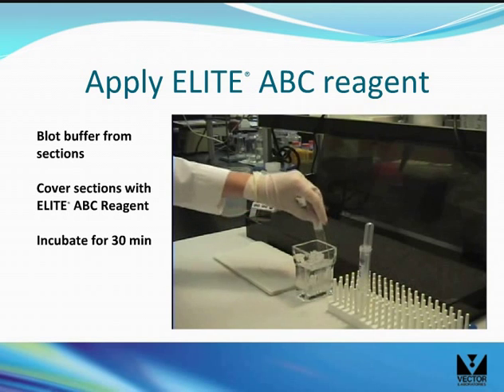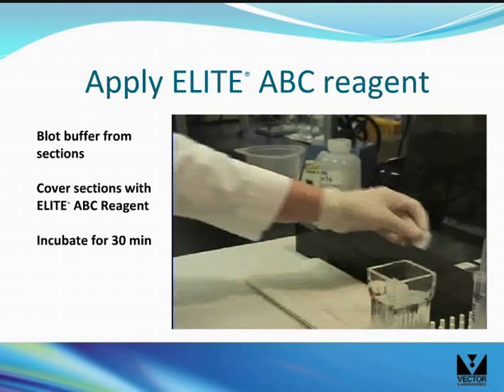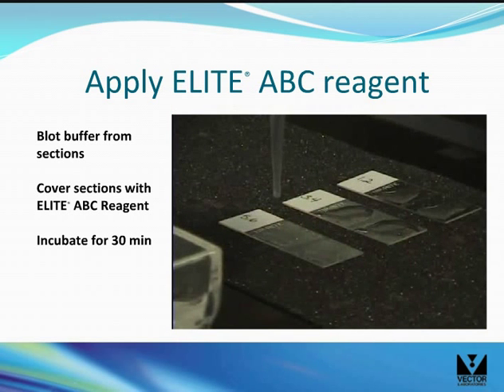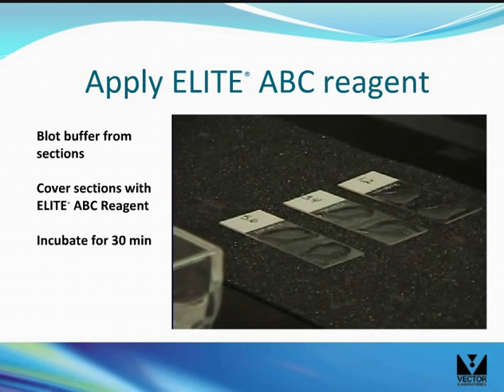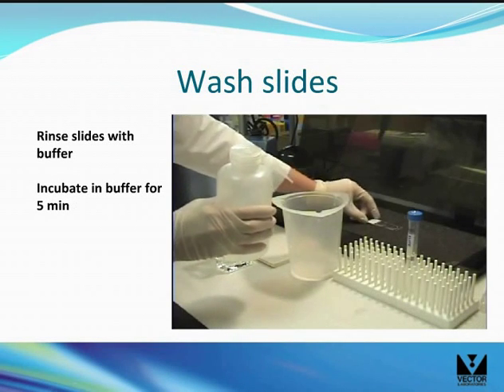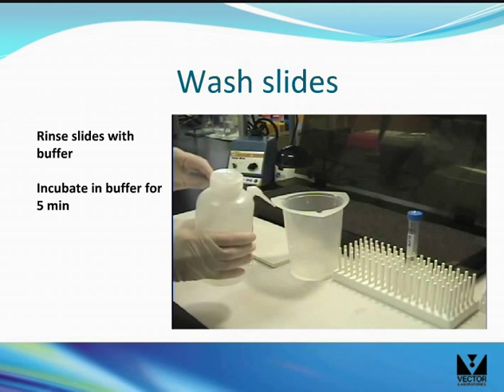Blot the buffer from the sections and cover the sections with the Elite ABC reagent. Incubate for 30 minutes. Rinse the slides with buffer, then incubate in buffer for 5 minutes.